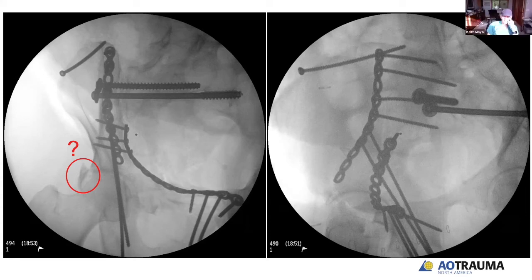Yeah, it's always a little disturbing when the displacement secondarily is worse than primary. It sort of makes you think that maybe you're not quite as accurate as you thought. But you could barely see it on the first axial. So I think before I did anything, I would get a new CT. I don't think I would base that on an intraoperative spin, but I'm not a big believer in that, even though we have it. But I'd get a new CT.